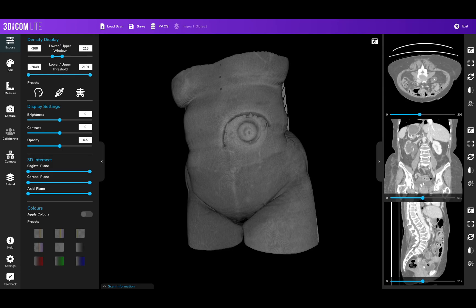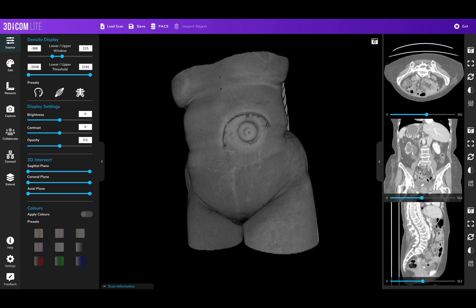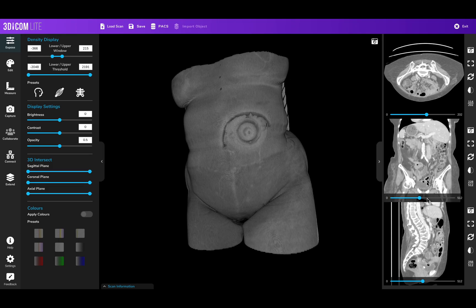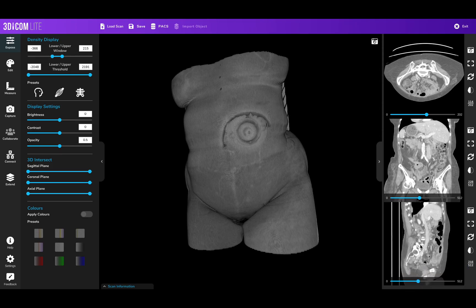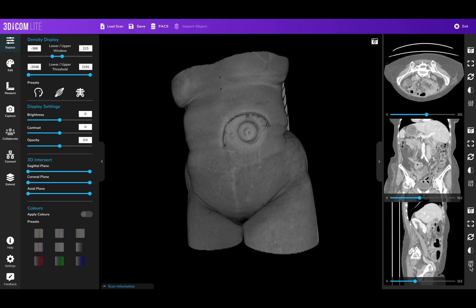We can also scroll through and look at all of the various slices in the axial plane, coronal plane, and sagittal plane, with the slice number being shown on the right-hand side. As we scroll through, we might get to slice 190, and we can click here to capture that image.